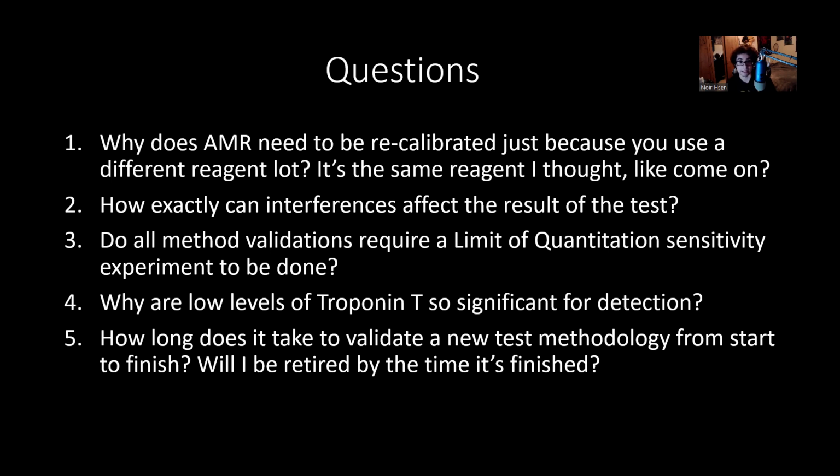So sometimes you need to go above the minimum amount of data. Maybe you need to get a lot of data. Maybe instead of a 10-day day-to-day testing, you gotta do a 30-day day-to-day testing. Maybe instead of 20 points, they want 60 or 100 points. Maybe they want method comparison with not just one institution, but a different reference laboratory. It all depends on the institution. So I would say a month to 3 months is a good measure.